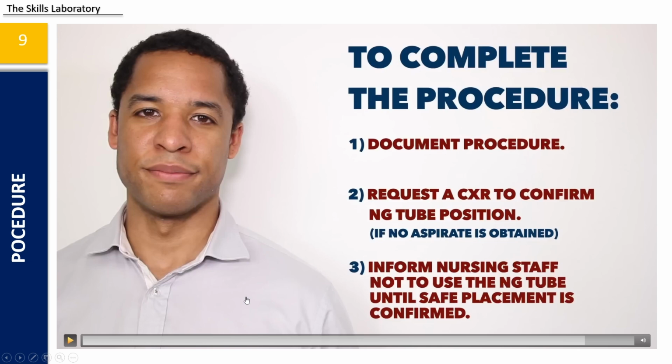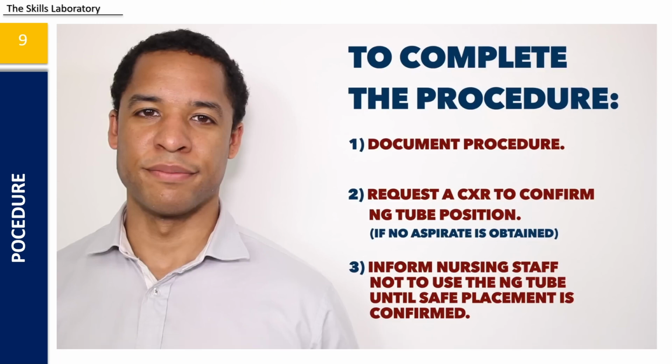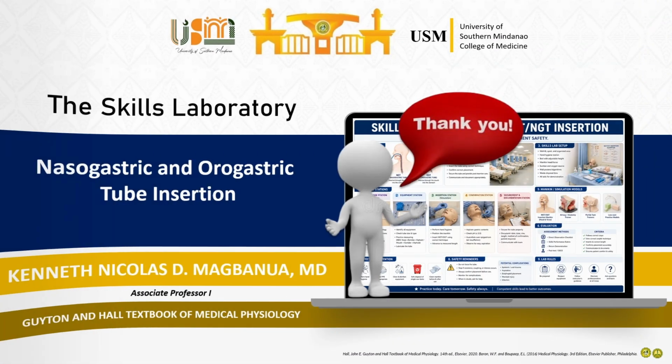Okay, so those are the very important things you have to learn for OGT and NGT insertion. So we're done with the procedure.